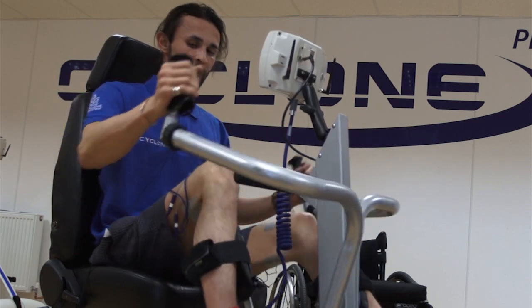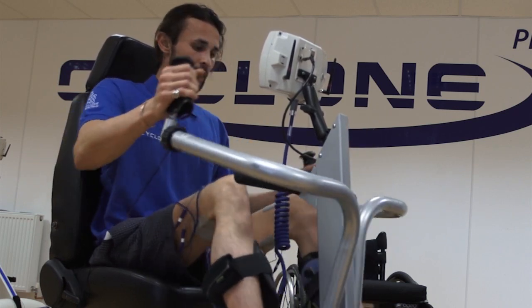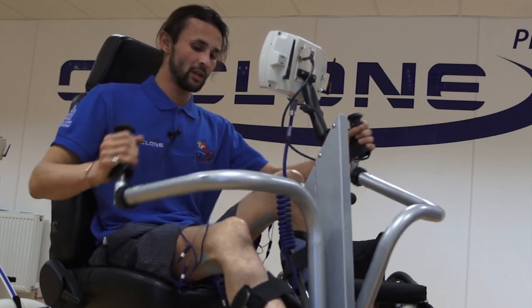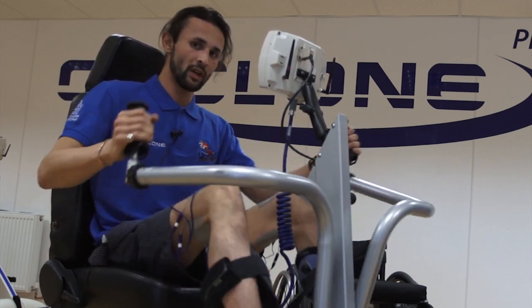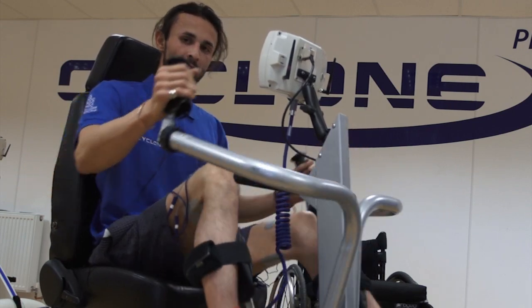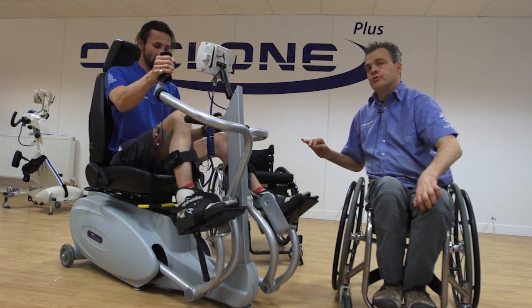The smooth motion means it doesn't feel bad on the joints, and obviously with myself being in a self-propelled wheelchair most of the time, my arms are very important to me. So looking after and taking care of my joints is very important. A machine like this is very useful.